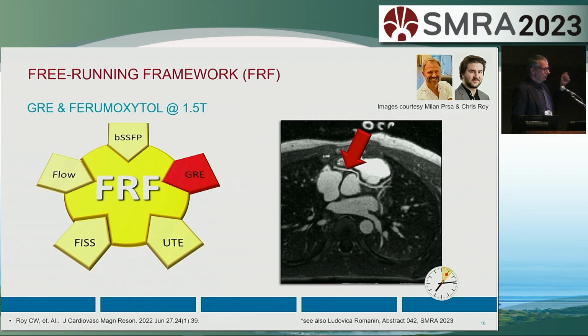And in a small child, you can get to this level of information, and even in a clinical sense. And so what's happening at our institution is that Milan Prsa, the cardiologist, now, for a certain age bracket of patients, he doesn't even need the patients to undergo general anesthesia anymore, which of course is very, very beneficial for the patient, for the staff, for the parents, for everybody. They only undergo a relatively light sedation, and that's it.